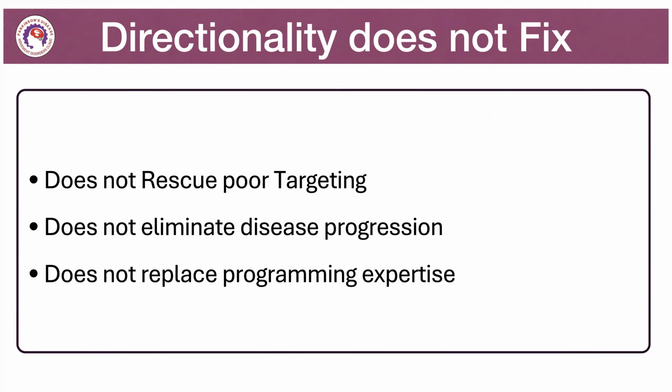Directionality does not rescue poor targeting. Let us be fair. It does not eliminate disease progression related issues. It does not replace programming expertise. And if you have chosen the wrong patients, it is definitely not going to help you out.